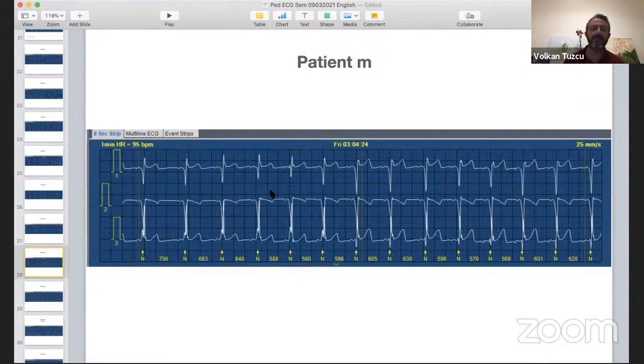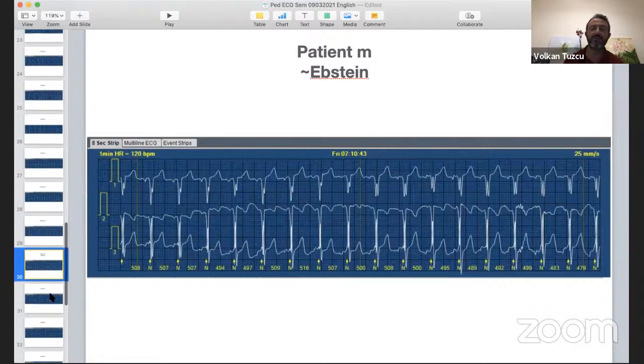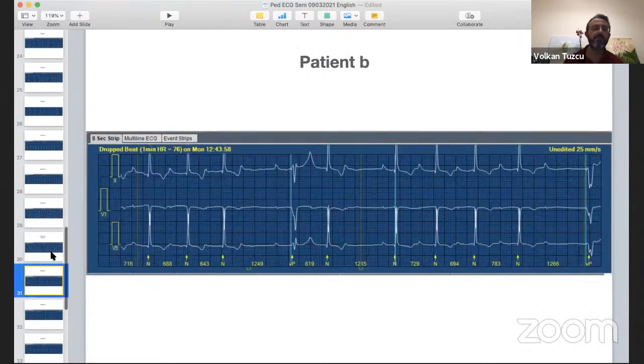These patients are especially at more risk. Again, if you look at the first lead, it's not intermittent actually. The QRS here seems to have less pre-excitation, but the QRS up here seems to have more pre-excitation because the shape changes. If it was really intermittent, you would have all narrower QRSs on all three leads. So whenever you see a change in pre-excitation, a change in the QRS with short PR, you should think of multiple pathways, which is higher risk in any patient, even more so in a patient with Ebstein, right? So you have to be careful about that.